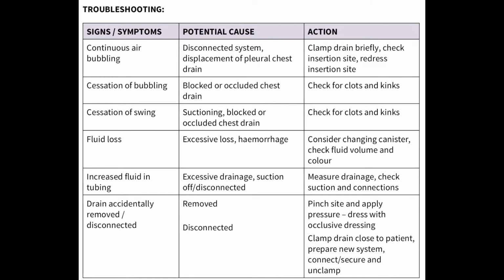So perhaps the most important part of managing a patient with a chest drain during transport is the ability to quickly and accurately troubleshoot any potential problems, to ensure that the drain continues to function properly and doesn't cause any issues for the patient. It can quite easily have ramifications such as redeveloping a tension pneumothorax and quite significant ventilation problems.